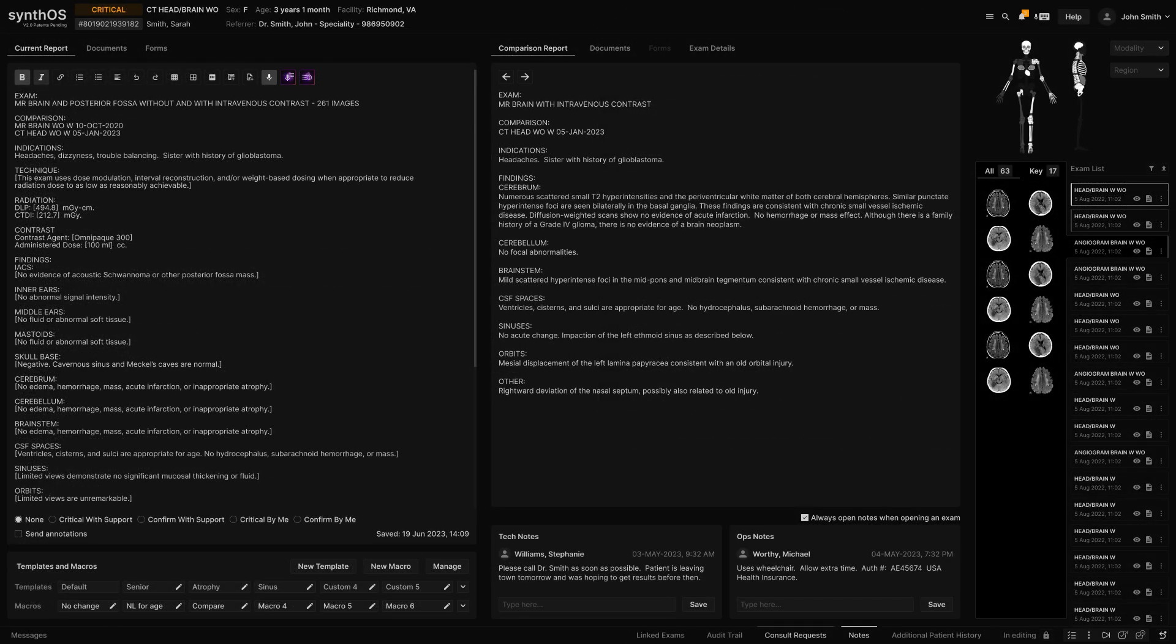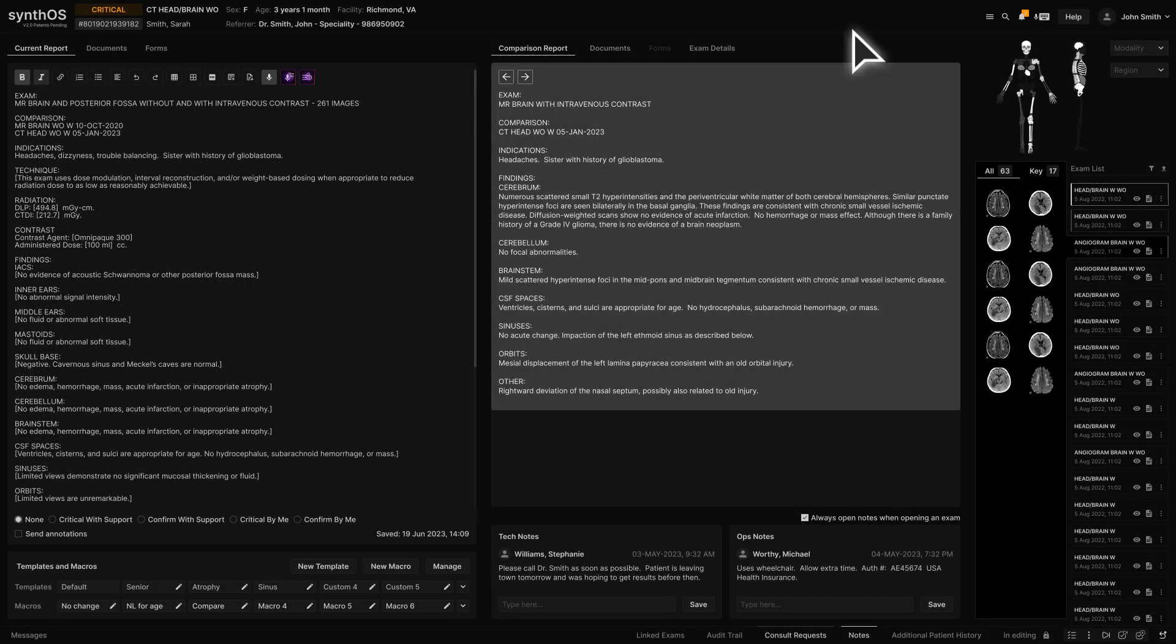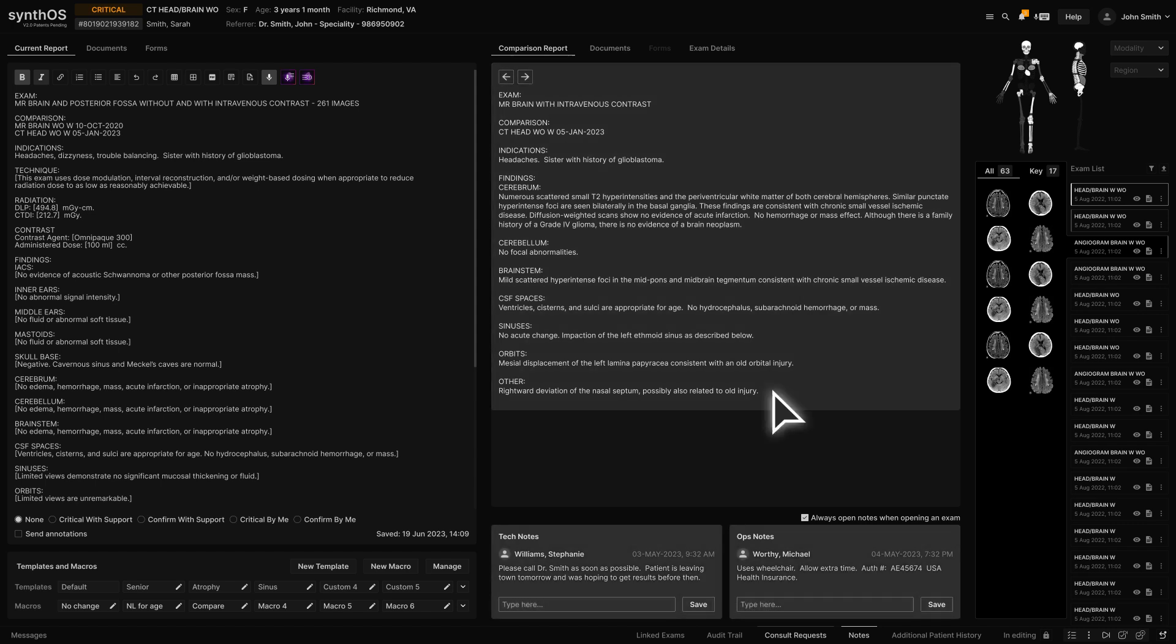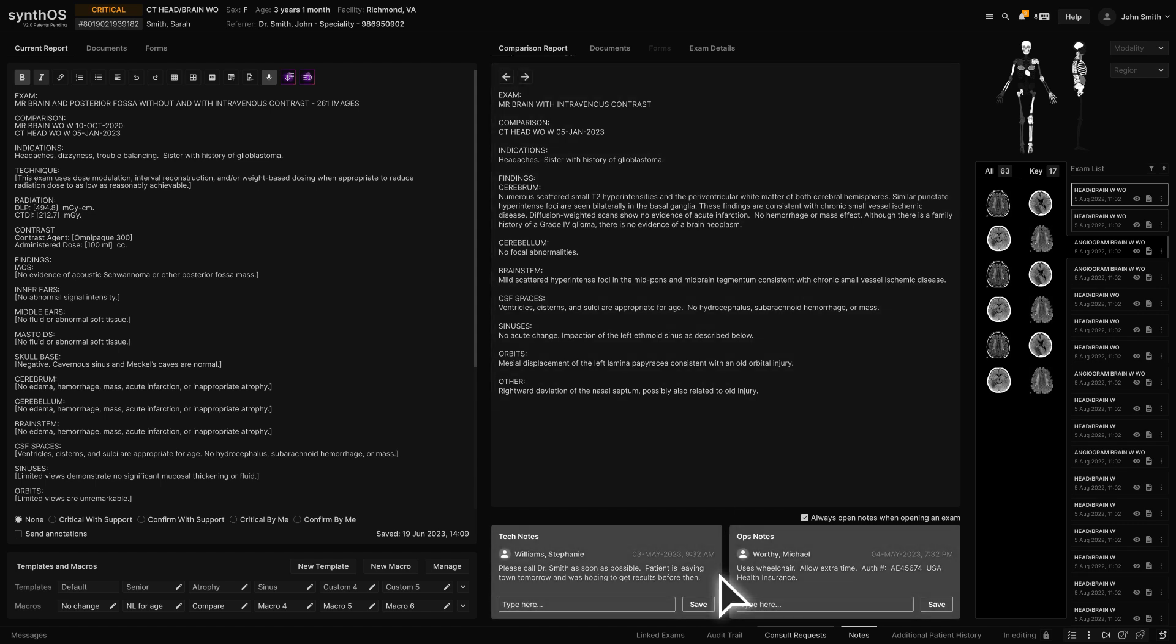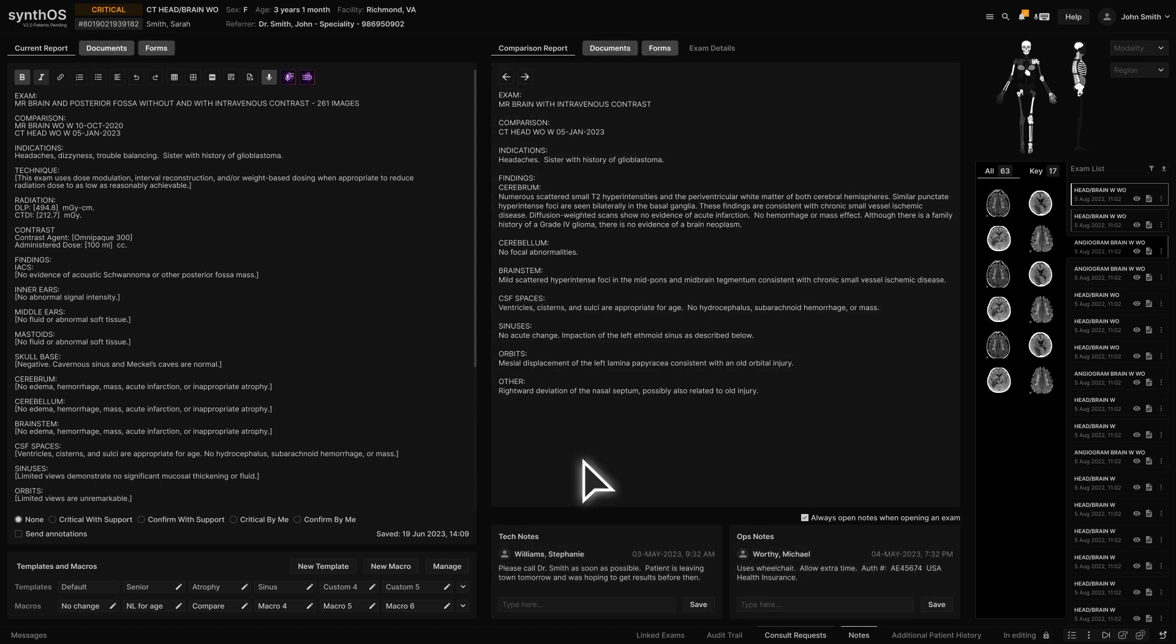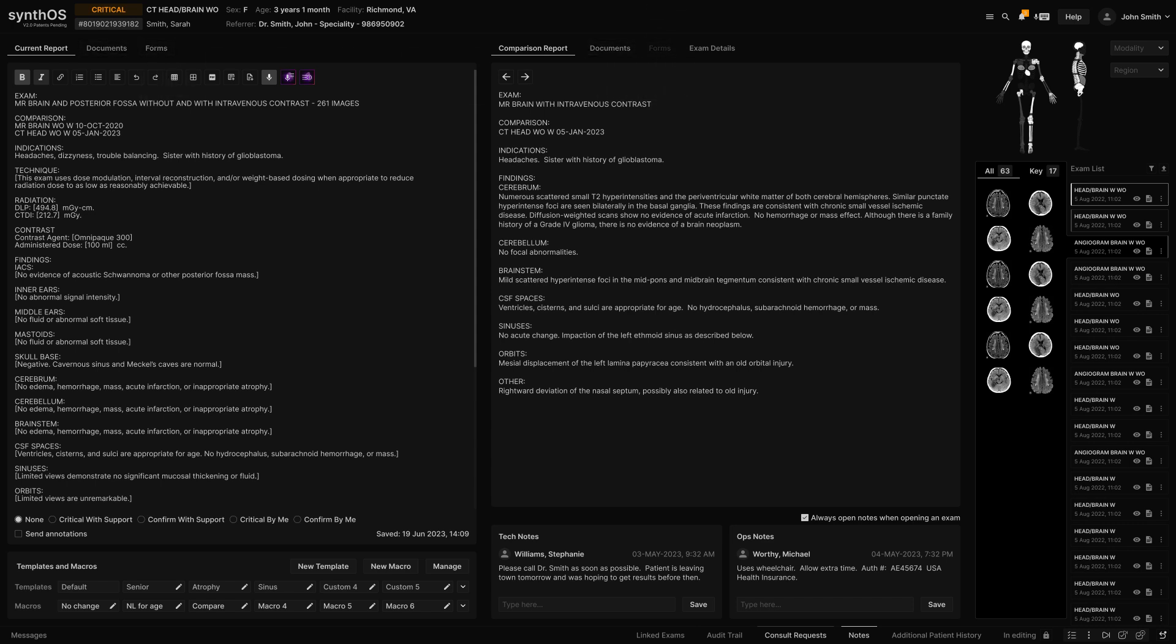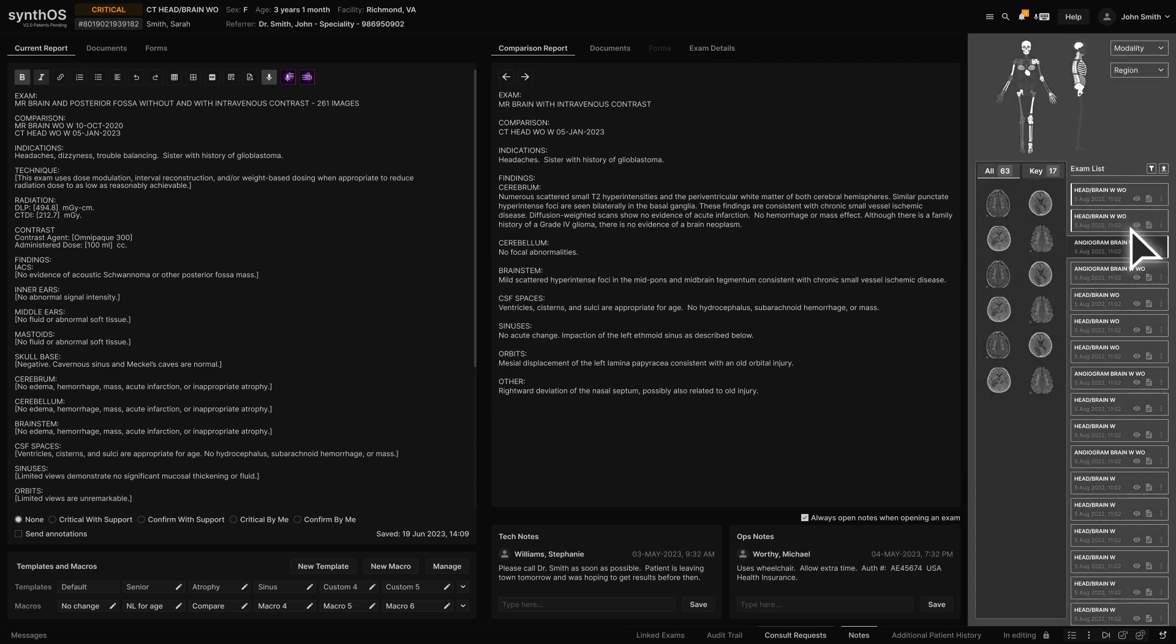You can see the prior reports, technical and operational notes, as well as any relevant documents or technologist forms from the current exam. You can also see additional exam details and an aesthetic list of comparison exams with standardized exam titles.